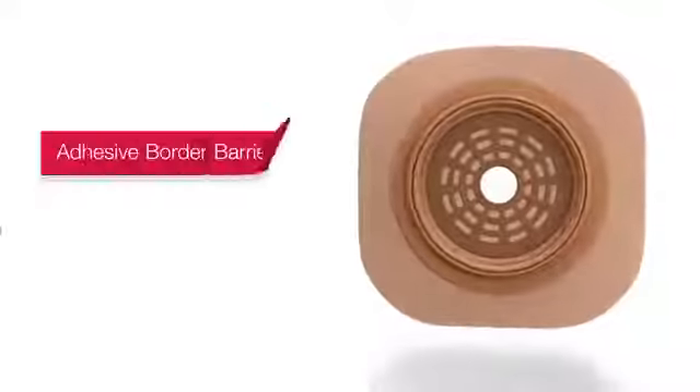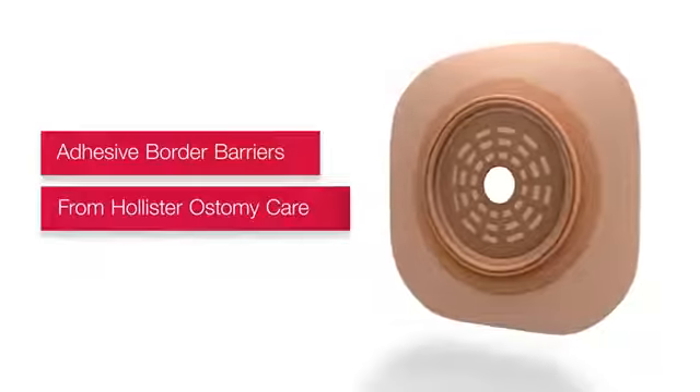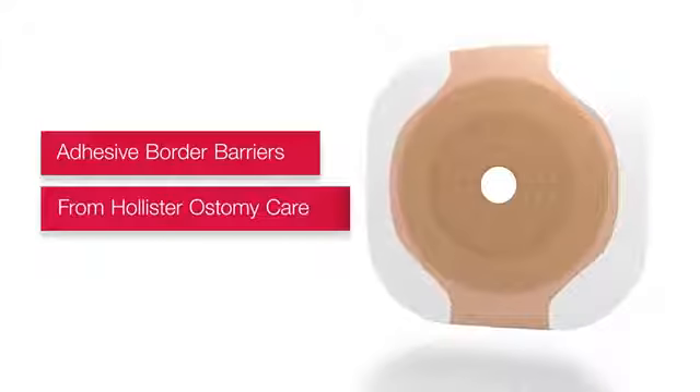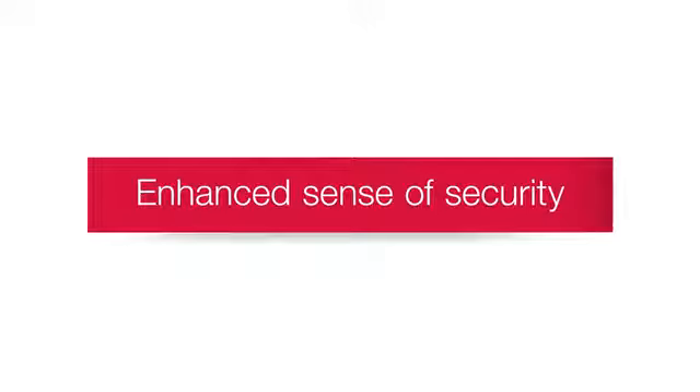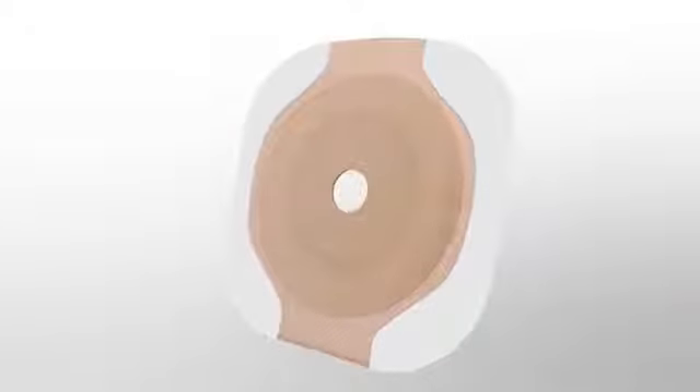Adhesive border barriers from Hollister Ostomy Care provide an option to help achieve optimal fit with confidence that's built right in. This confidence comes from the addition of adhesive that surrounds the hydrocolloid barrier. This adhesive is designed to be gentle on the skin while providing an extra sense of security.